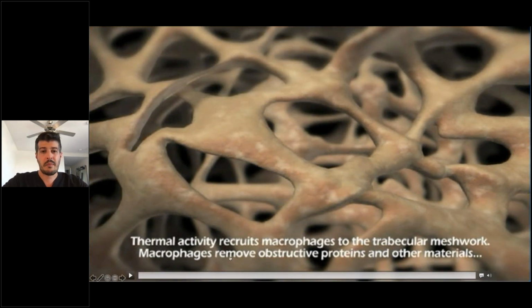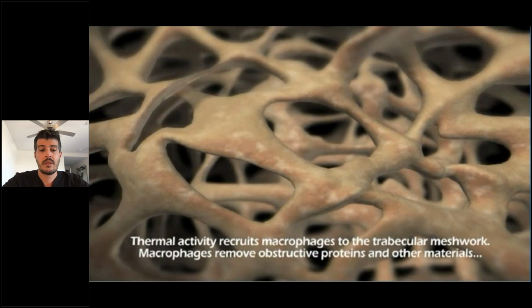So as we just talked about, basically the laser engages these melanin pigmented cells, and they produce the inflammatory cells, the macrophages, and that's how we think SLT works. Here's a video we actually took with the help of LIGHTMED and Advancing Eye Care this week. This is just from a few days ago. And the red light is where the laser is aimed at, obviously.